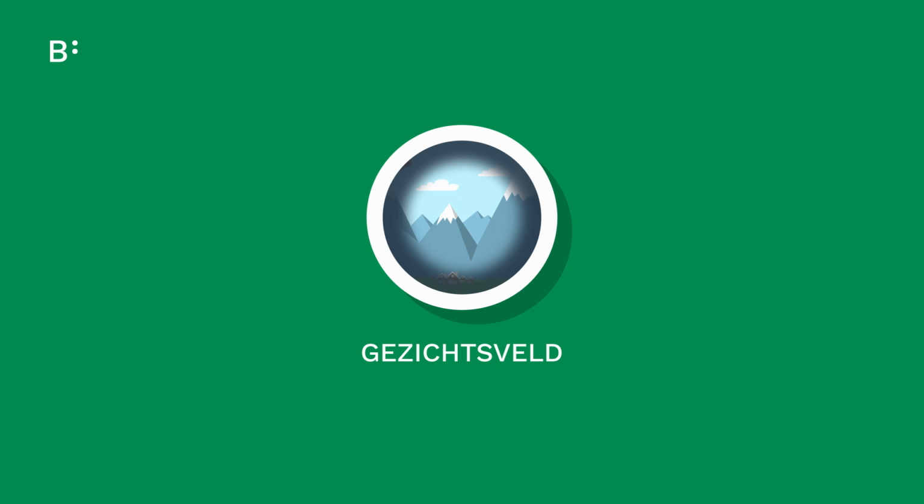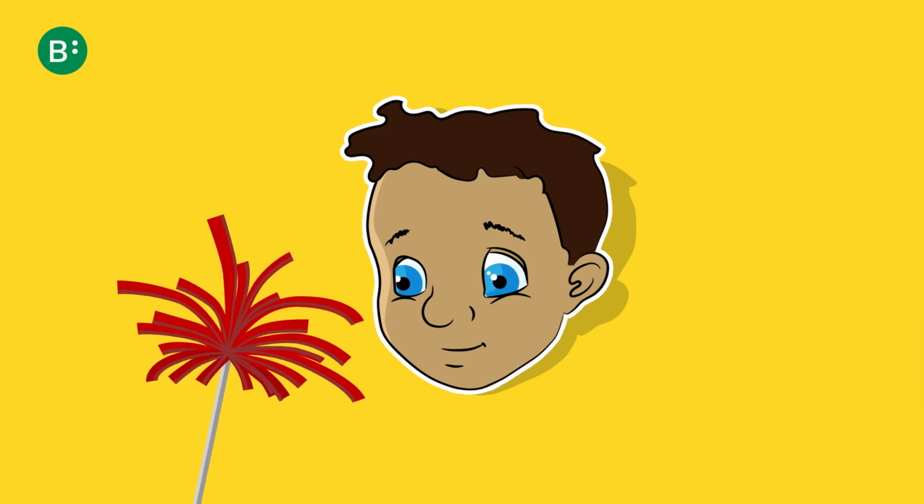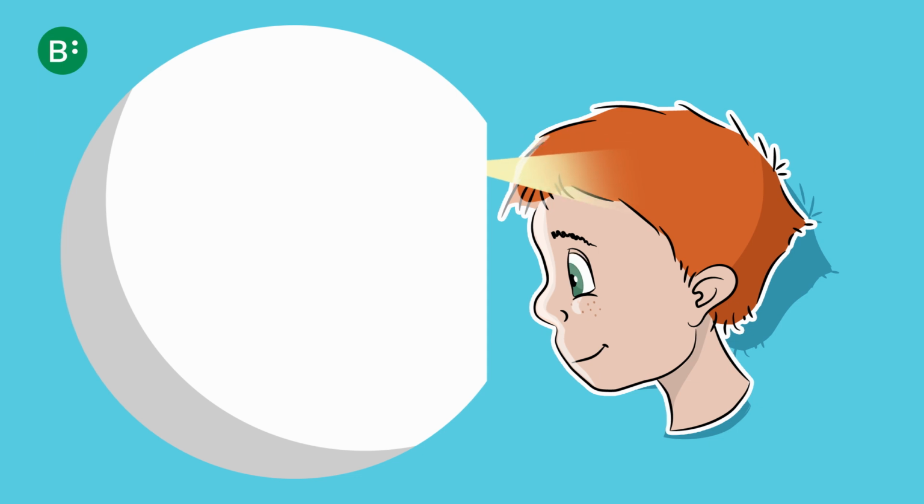Visual field testing. With the 4 to 5-year-olds, we assess visual field by showing objects in front of them and coming from different directions. This is usually a small white ball, or a brightly coloured object on a long thin stick. With older children, we use a computer to assess their visual range. The children are asked to press a button each time they see a fixed or a moving light within a large sphere.